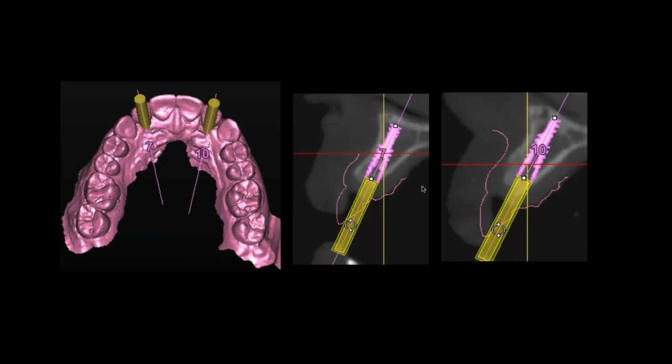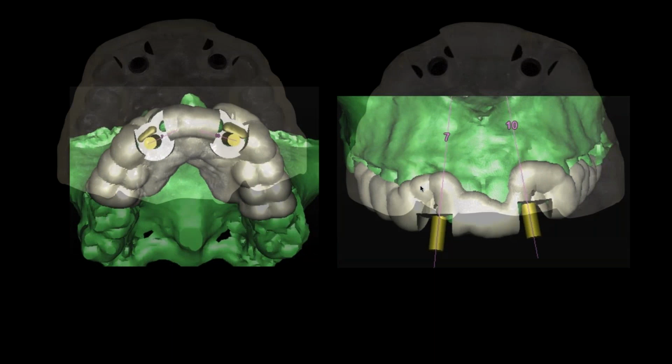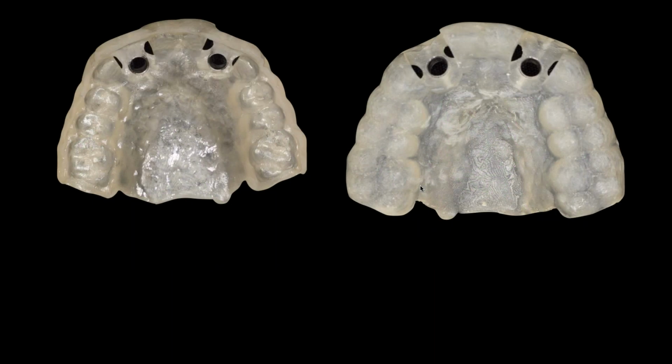Now, the other thing we want to do is do an immediate restoration. So here's the plan. You just press a couple buttons and you get through CT guide. And then you upload it and send them a model of the patient so they can get the occlusal surface squared away. Or you can upload an intraoral scanner if you want. So I did it this way.